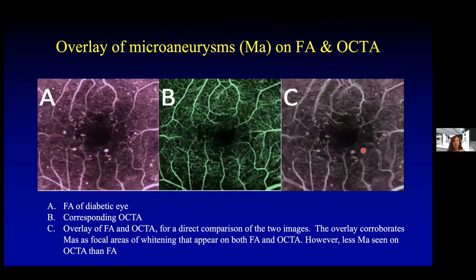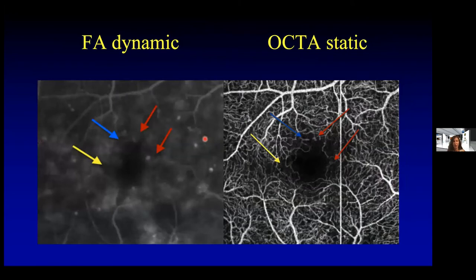Here's an interesting image showing an overlay of microaneurysms on fluorescein angiography — image A shows fluorescein with white microaneurysms, image B is the OCT angiography of the same eye, and in image C, the fluorescein and OCT-A are overlaid, showing that regions of microaneurysms correspond to small microaneurysms on OCT-A. However, there are differences between fluorescein and OCTA for microaneurysms because fluorescein is dynamic — the dye can pool in microaneurysms over time — while OCTA is static, showing the image at that moment. So if there's very slow or stagnant flow in a microaneurysm, it might not be shown on OCTA.